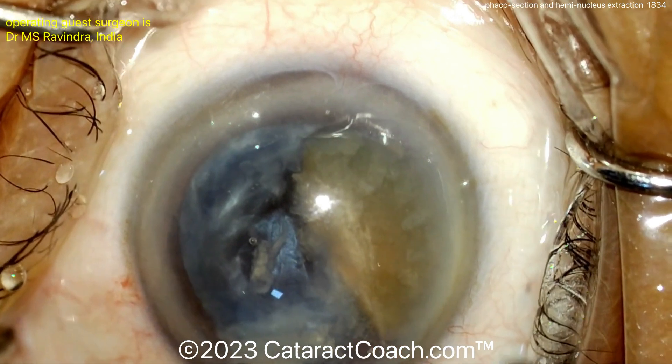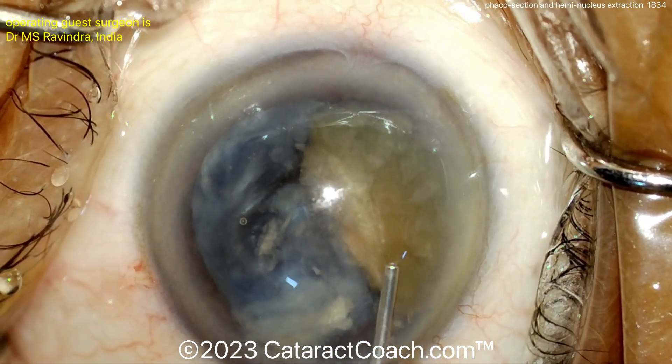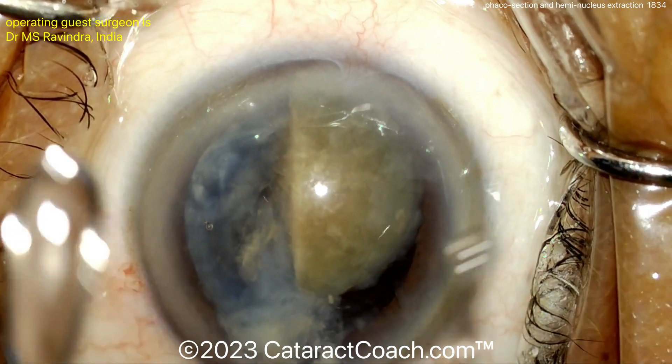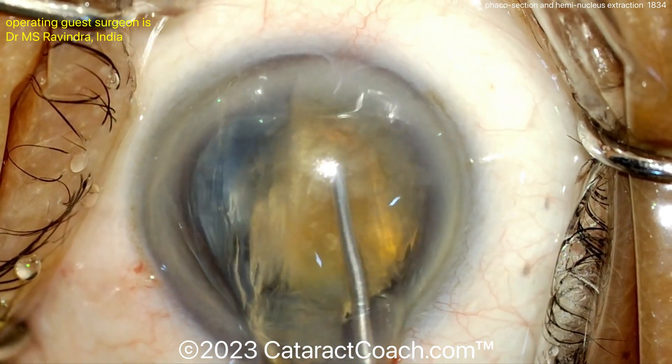Now sandwich technique to hold it, and you can pull each half out of that incision. There you go — there's one half. Take out the other half now, and you've removed that entire nucleus without using a phaco probe, through a smaller incision than you would have made with a typical SICS procedure.